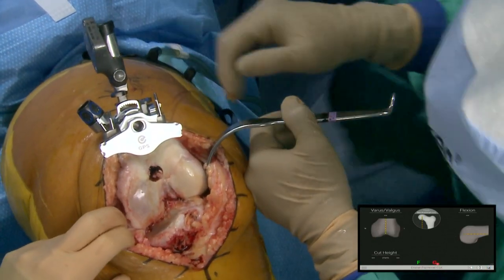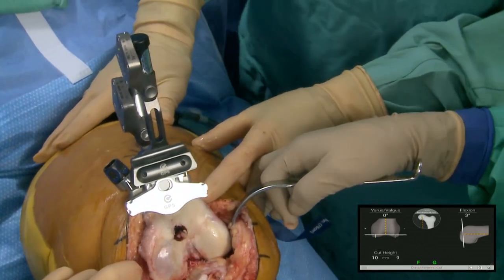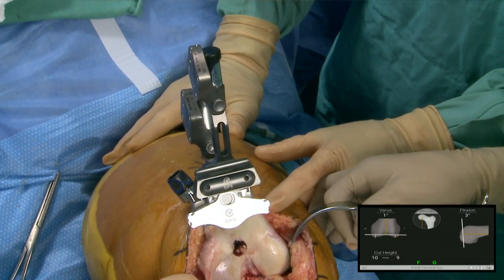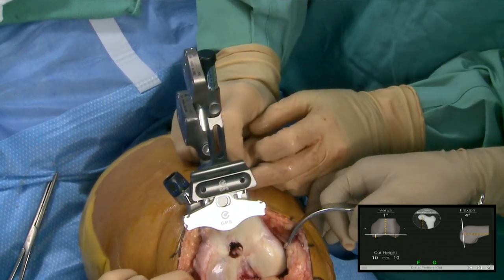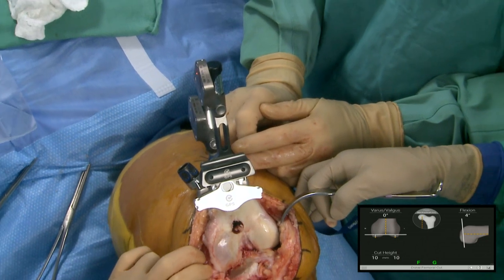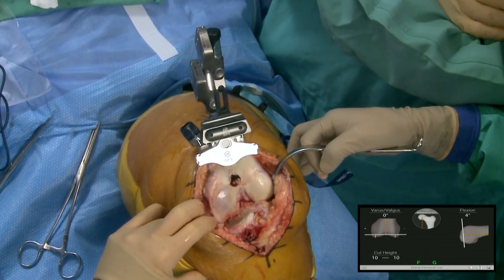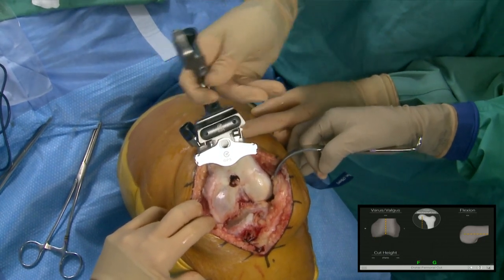I'll adjust the flexion to four degrees. We're going for zero on the varus-valgus, so I'm in one degree of mechanical varus. My cut height is giving me 10 millimeters off the medial and lateral side to get zero degrees. Now I'm at least one degree better than I would have been if I had just gone ahead and cut it without navigation. Now we'll make our cut.